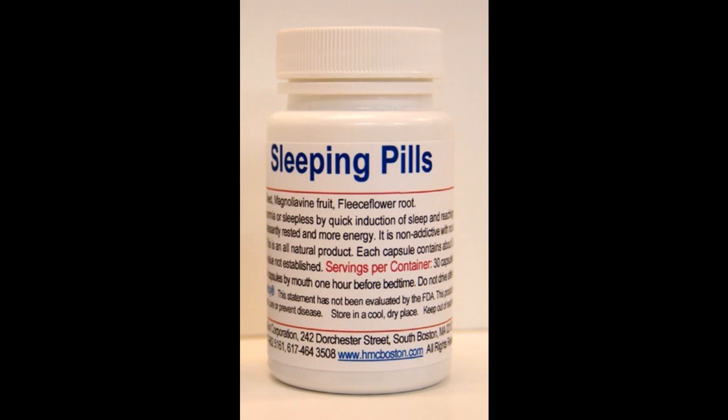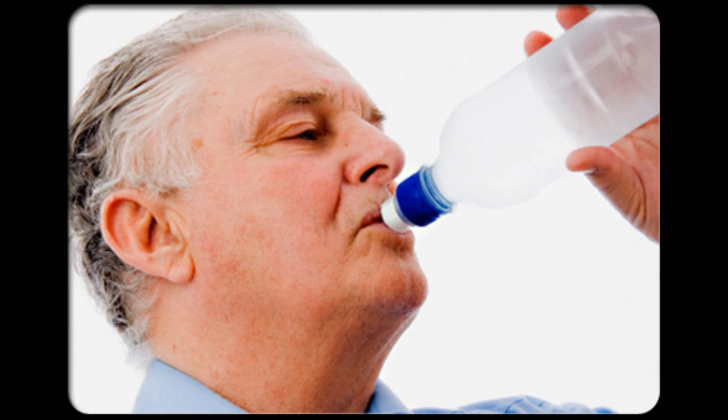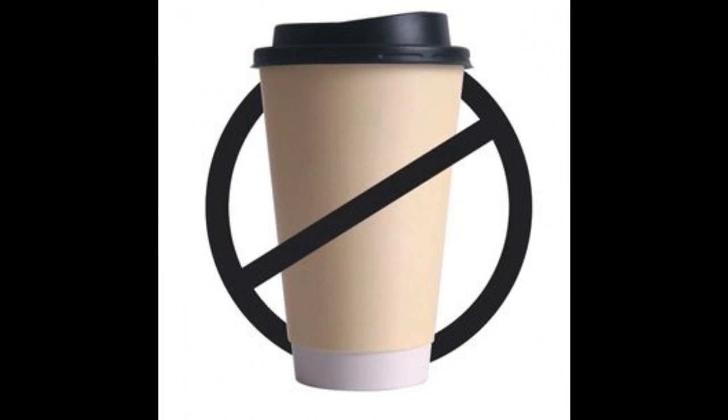Do not take sleep aids or sedatives the night before the test, and your doctor may recommend that certain medications, such as anti-epileptic drugs, that can alter results be held before the test. Foods and fluids are permitted and encouraged, but avoid caffeine up to 8 hours before the test.